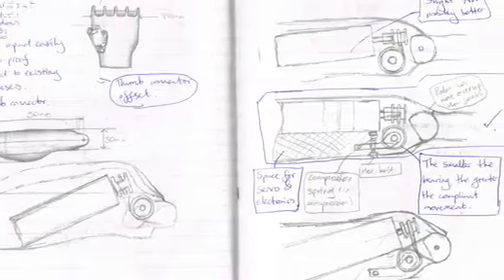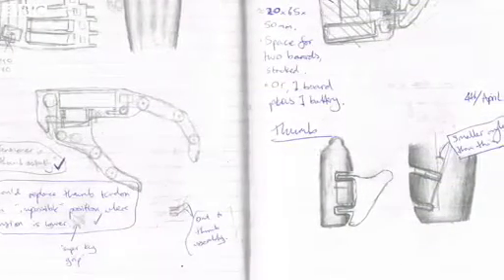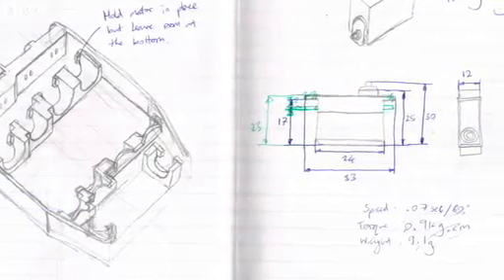I've always been interested by the human hand. From a robotics perspective it's a very complex part of the human body, and as a roboticist I wanted to try and replicate that in a way that gave somebody comparable functionality.